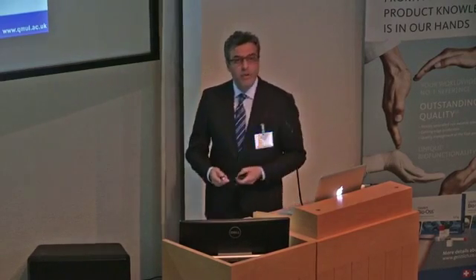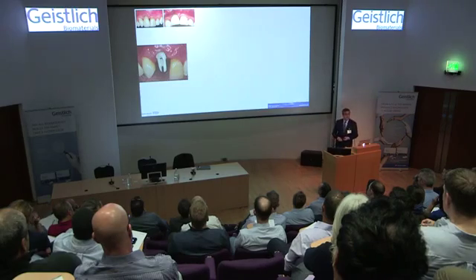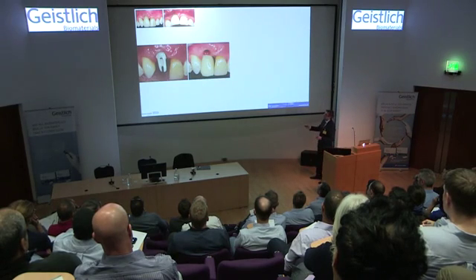And there's only one way to treat this patient today, and that is by removing the implant and explanting the implant. Because when we take the crown out and we look at the abutment, you can already see where the problem is. Look where the screw access hole is. And we removed the abutment. The implant is still in place. I've placed a provisional resin-retained bridge.